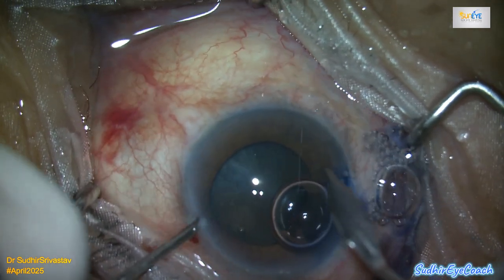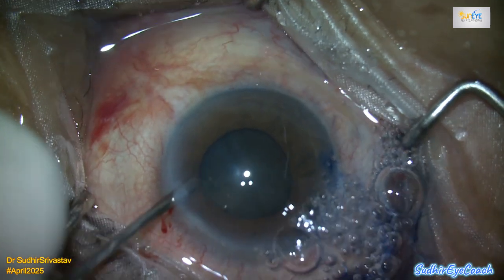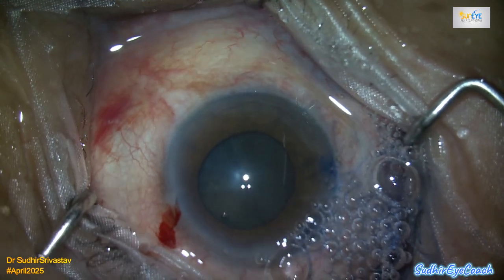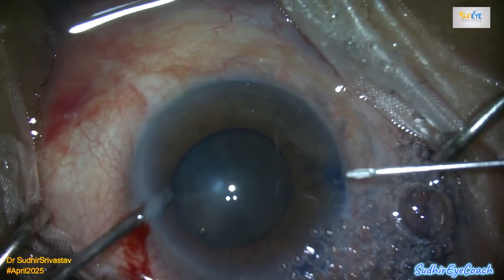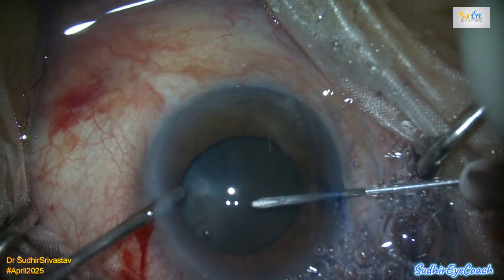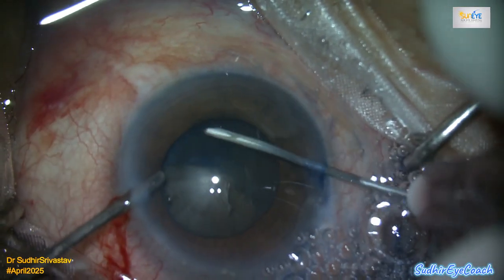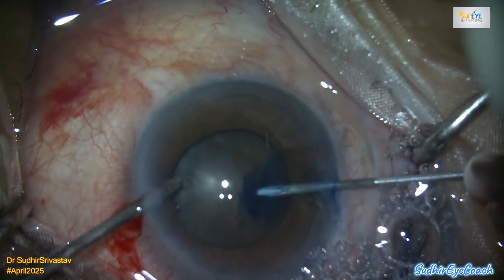If the pupil is small and you are still learning, there is a high risk of catching the iris with your phaco tip, which not only makes the surgery difficult, but also causes the pupil to constrict even further and complicates things. Here in this case, I managed the entire surgery without any pupil expansion devices, thanks to my 20 years of phaco experience.